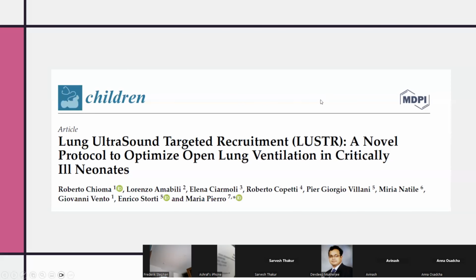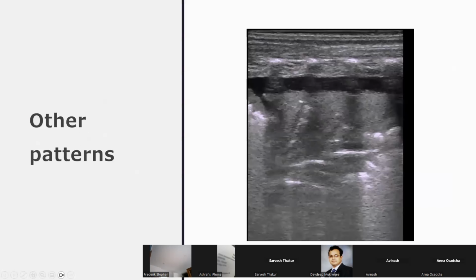Yeah, Alok, one question. In this particular baby, if there is effusion, still this positioning, putting the left side up, would help. In case of a collapse, when a part of a lung is collapsed due to secretions or whatsoever or blood, that helps in that condition.